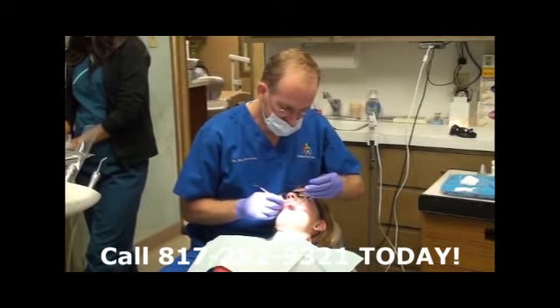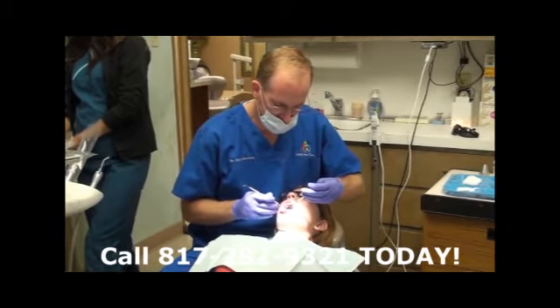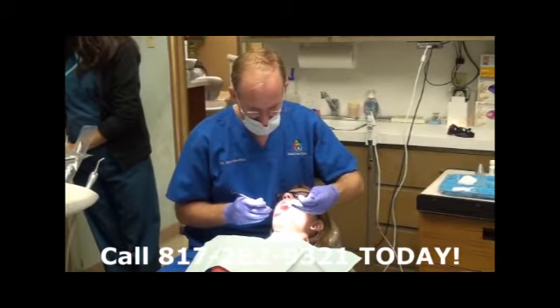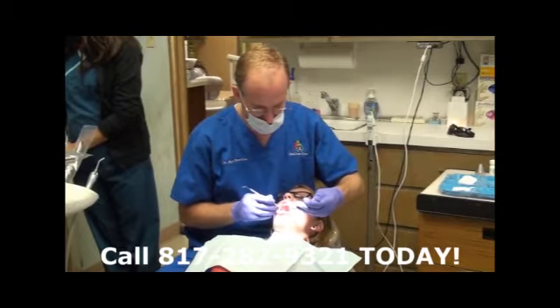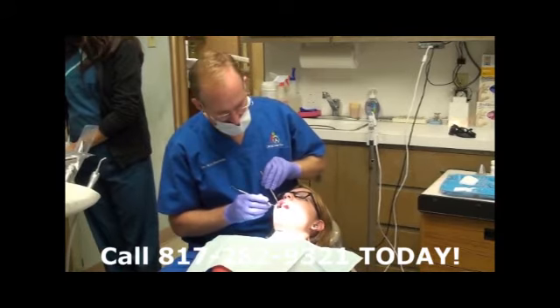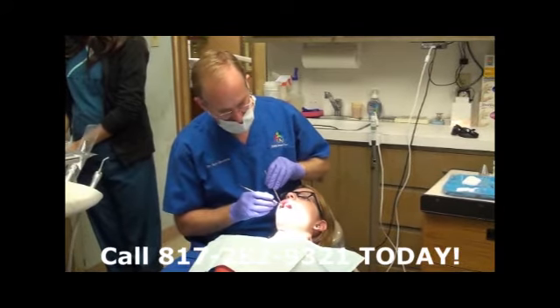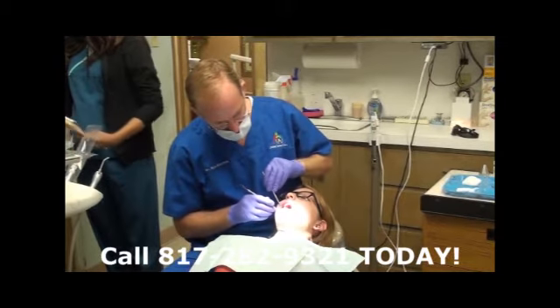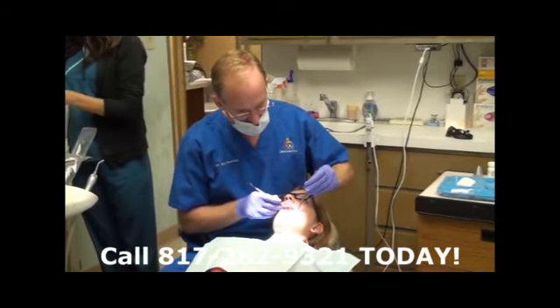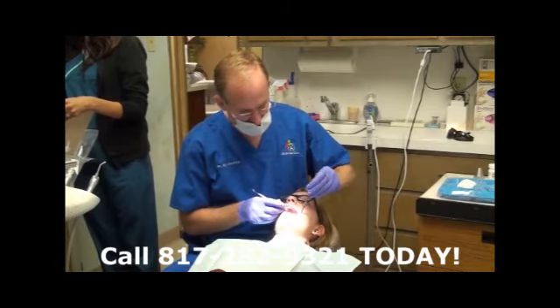You just check your gums. Now, this may be a little tender, especially if you haven't had cleanings in a while. You can see there's a couple spots that show that it starts to bleed a little bit. That tends to indicate gingivitis. So the same thing that causes cavities can cause gingivitis. And if you don't control that, then that will turn into what they call periodontitis, which is a gum disease.